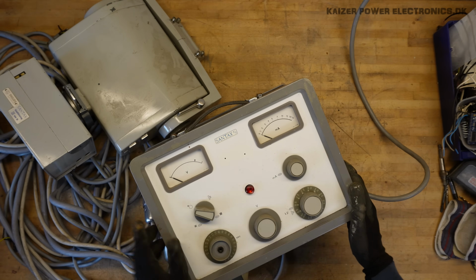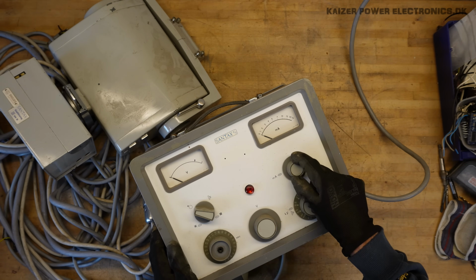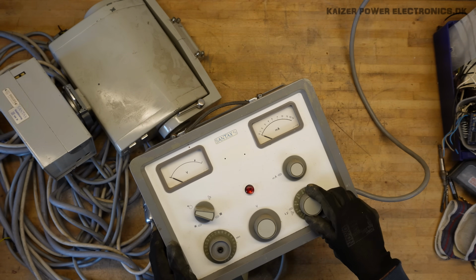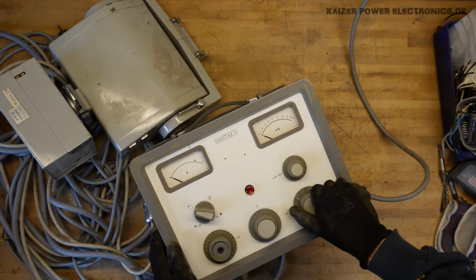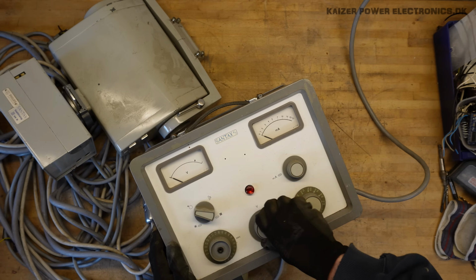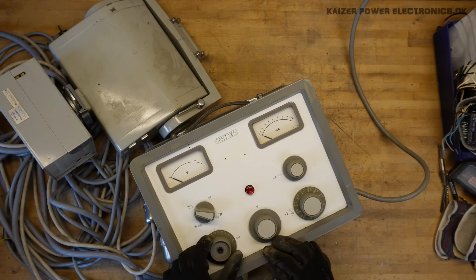It features a voltmeter, a milliamp meter, what is presumably a status lamp. We have a milliamp adjustment potentiometer here. We can set the kilovolt over here. There's a... okay, that's some kind of voltage stepped switch. Then we have a timer. It goes from 0.04 seconds and up to 5 seconds of exposure time. And then there is a selector switch here that we can use for small focal area or large focal area.